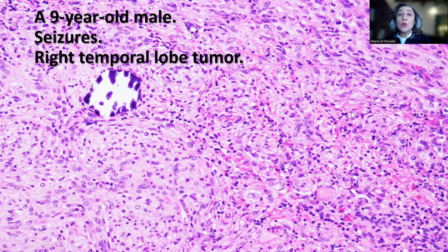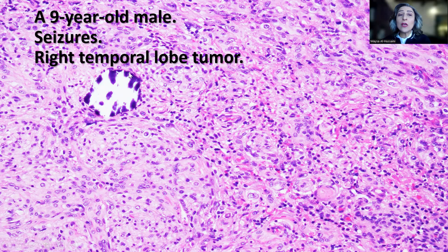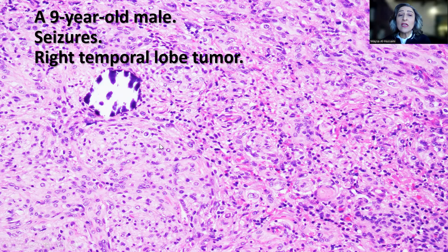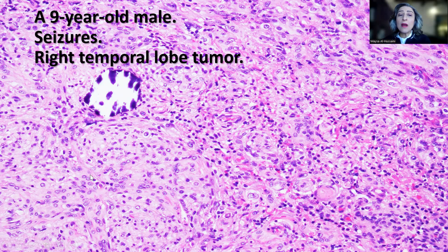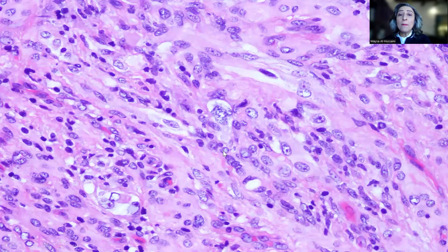This is the low-power magnification of the tumor, which was very cellular, showing some calcification and some tendency perhaps at a whorling growth pattern.